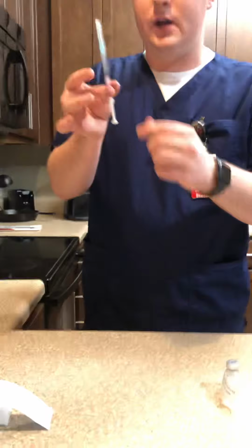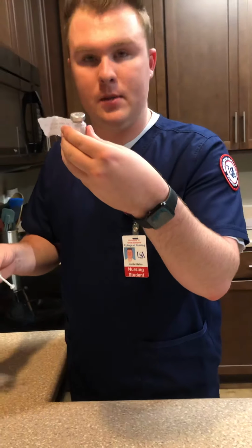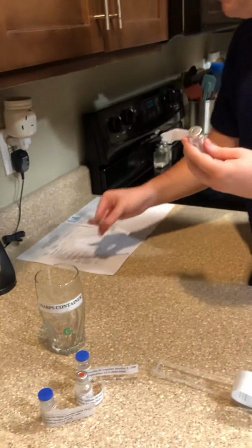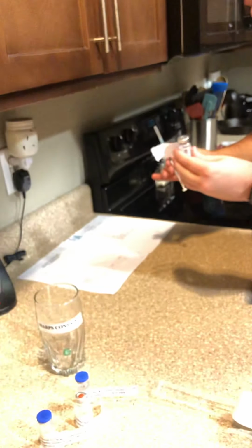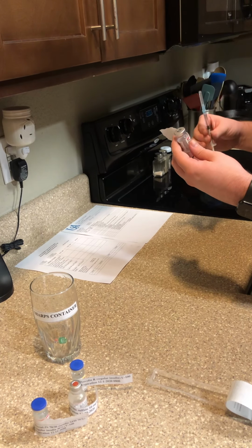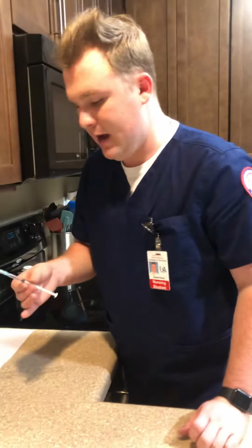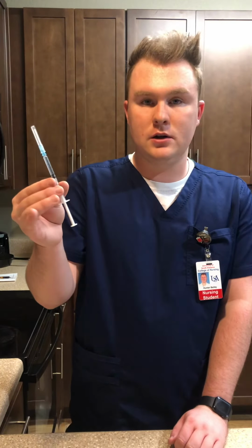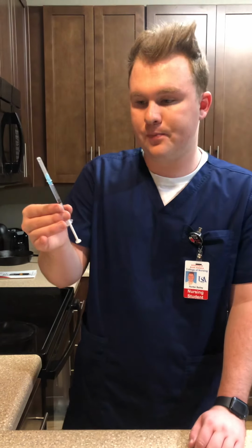Now that I have drawn up the medication, I want to look at the medication vial again. I drew up heparin, and the order is for heparin, 5,000 units. This is 10,000 units per milliliter, so I would give half a milliliter, and I have half a milliliter. I'm going to give this subcutaneously every 12 hours. What I would do now is verify with another nurse to make sure that I drew up the correct medicine and dosing and that my calculations are correct.